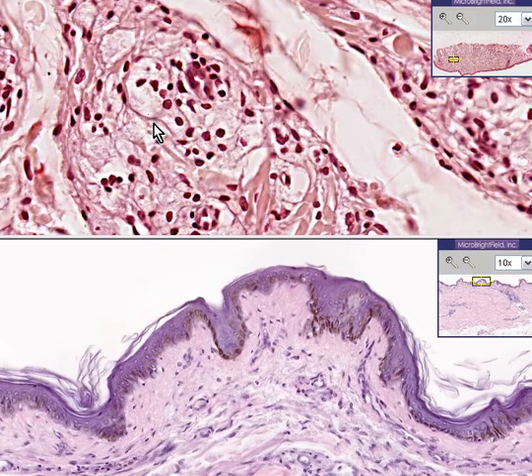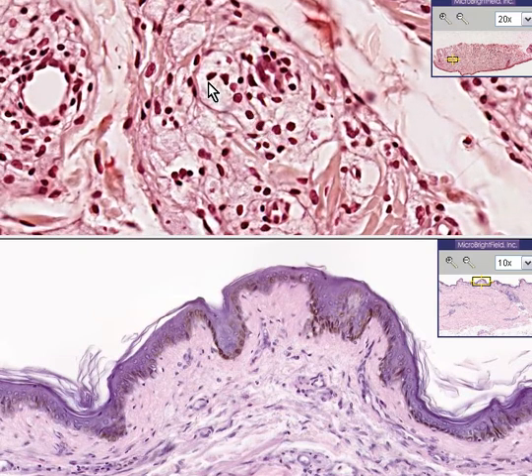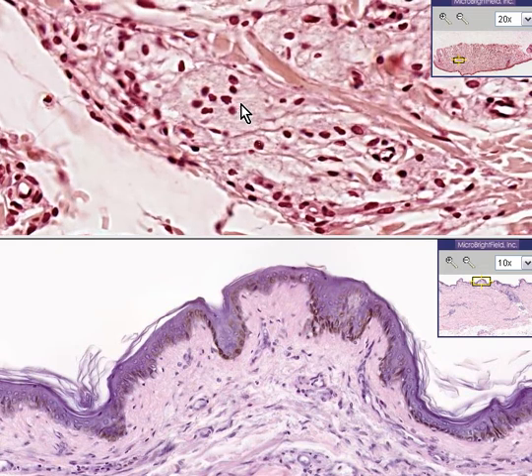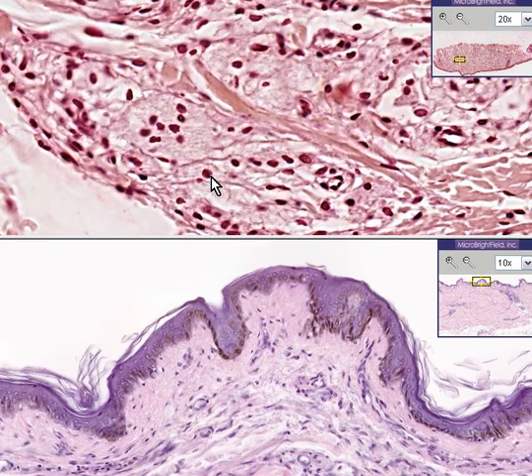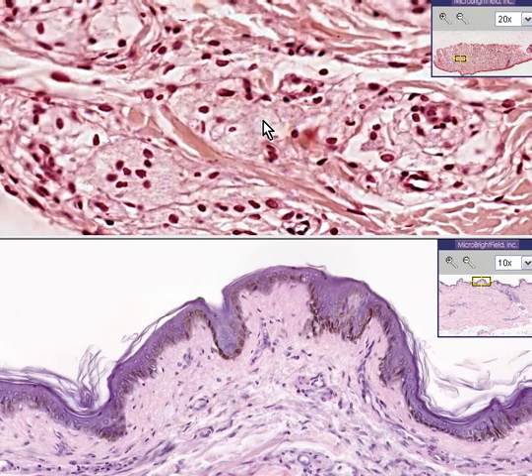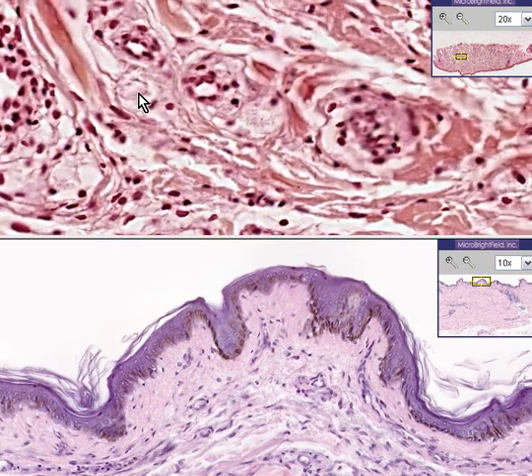The reason why the cells are yellow and foamy, you might have guessed it already because we've seen it in so many other places, is because these cells are filled with fat, chiefly cholesterol, but other things. In some areas, it almost looks like they are multinucleated, like here. All of these are xanthoma cells. Here's one, here's one, here's one, here's three, here's three or four. Prominent foamy cytoplasm filled with fat, cholesterol, as well as other fats. I think cholesterol is the chief fat, though.